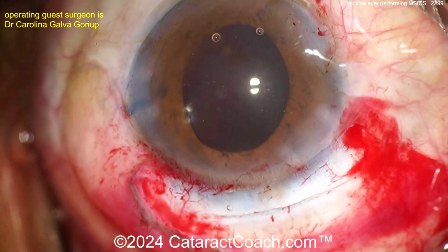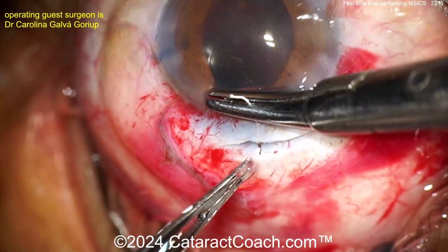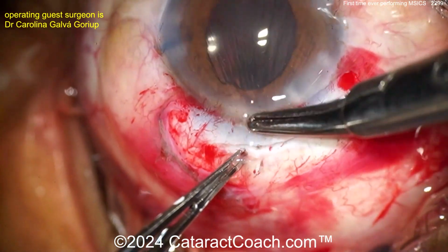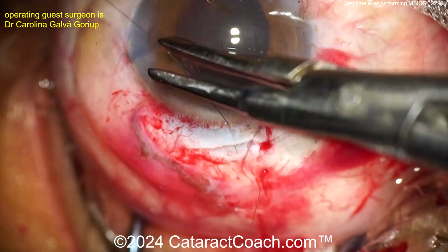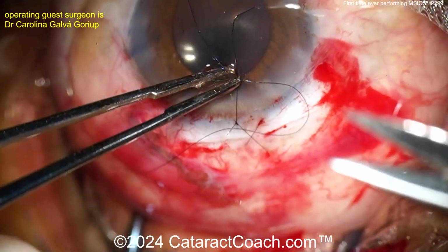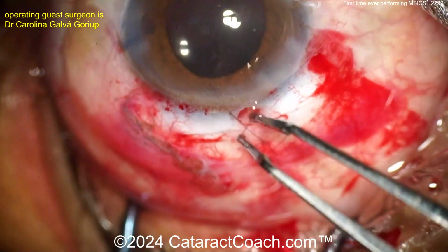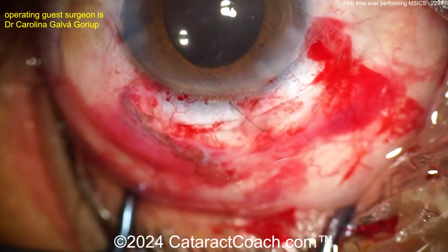Fantastic. And now at the end of the case here, yes, suture of the incision. Now, I've shown you videos where some very experienced MSICS surgeons don't even use a suture. I like to put a suture or two in, put a couple in, doesn't hurt anyone. It's kind of fun to keep your hands fresh, learning, remembering how to do sutures. So once that's sutured up, rotate that knot, get it buried.